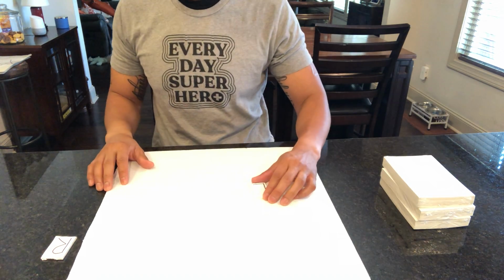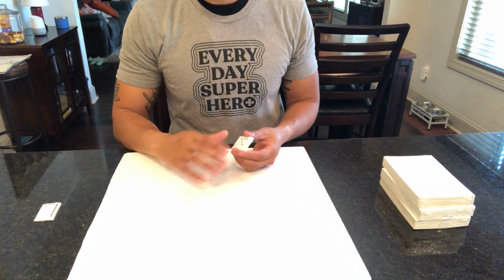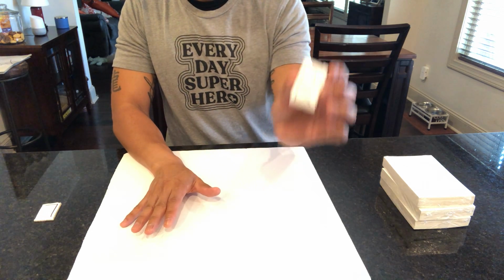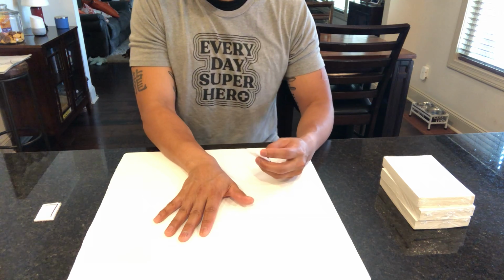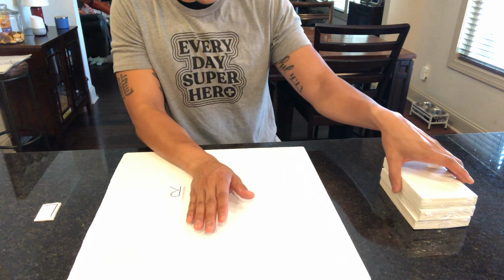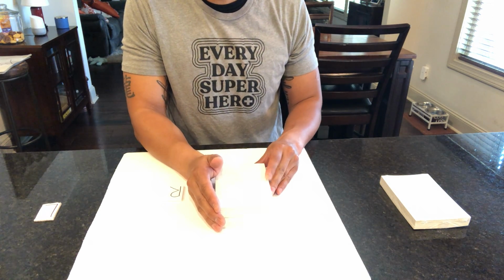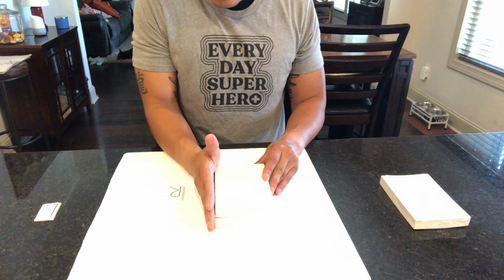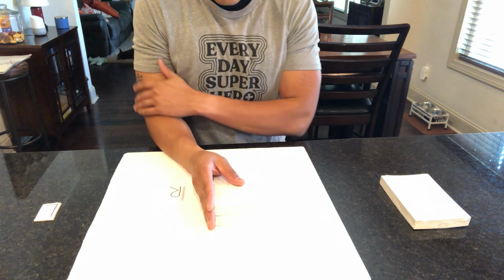Now let's move on to thumb projections. And in this case, we're going to use the right thumb as the affected finger and right marker. So in this case, we're going to start out with a PA thumb view. Place the marker here on the right side. Again, index cards are going to be simulated as my sponge. We're going to put the knife edge down and rest the thumb.